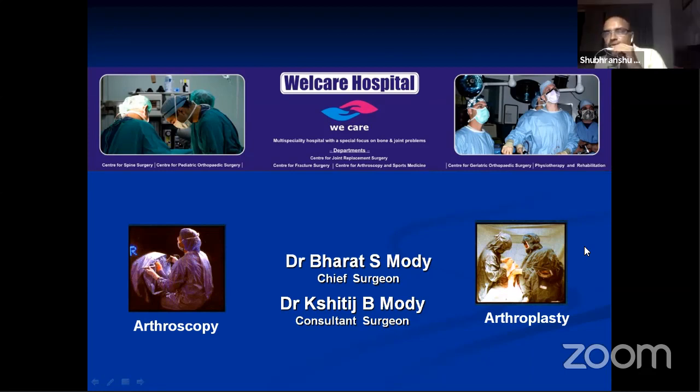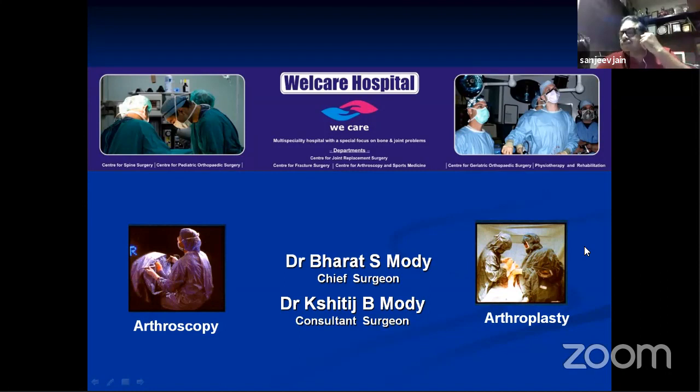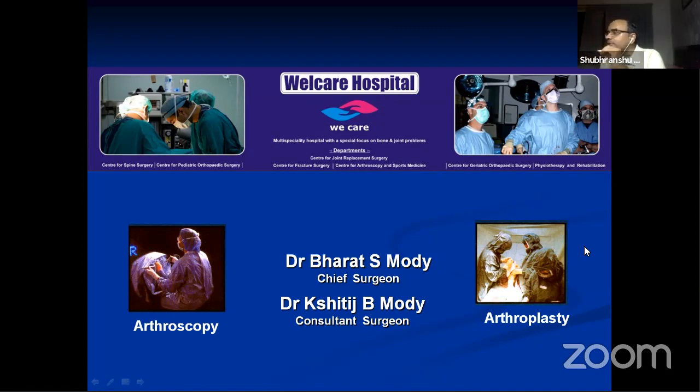Okay, there's a question from Dr. Smarajit Patnaik. Dr. Jain, how do you approach your medial side exposure and proximal tibial cut in a valgus knee to reduce your constraint, especially in grade 2? The approach has no issue with the same medial parapatellar approach. So you can get away with the medial parapatellar approach. Any need of tibial tuberosity osteotomy, as these cases have patellar problems also?